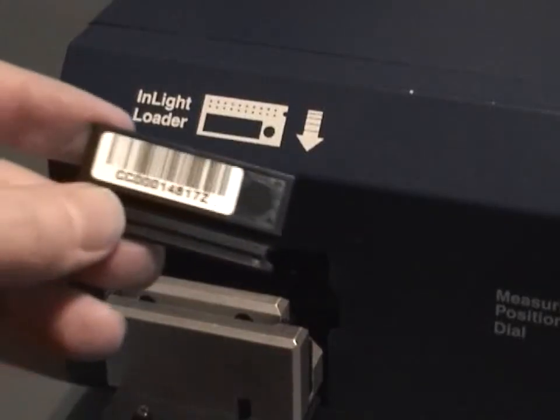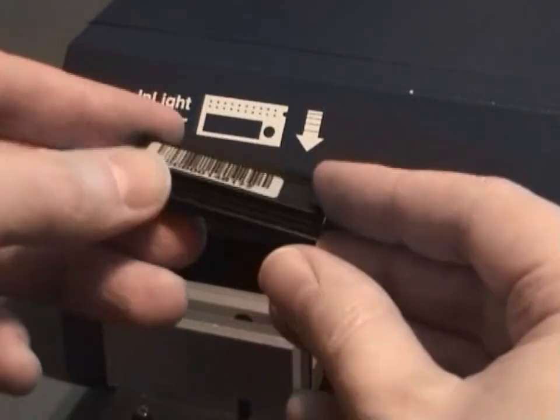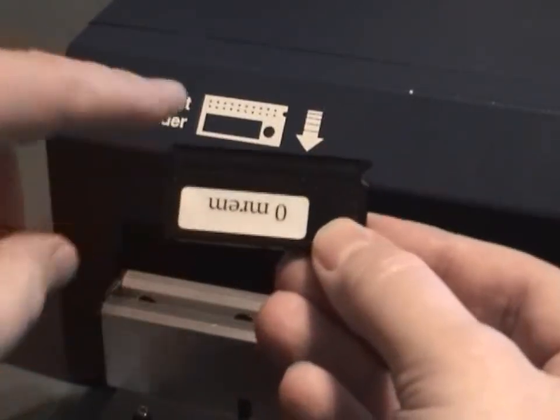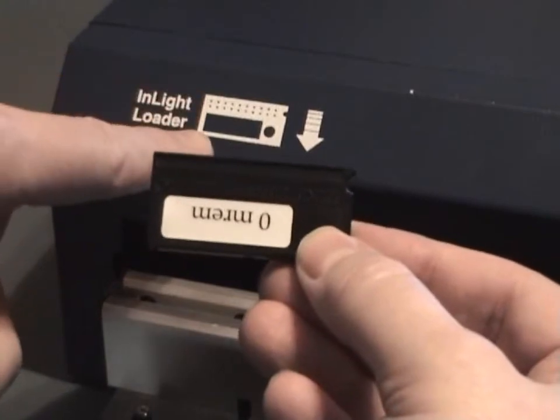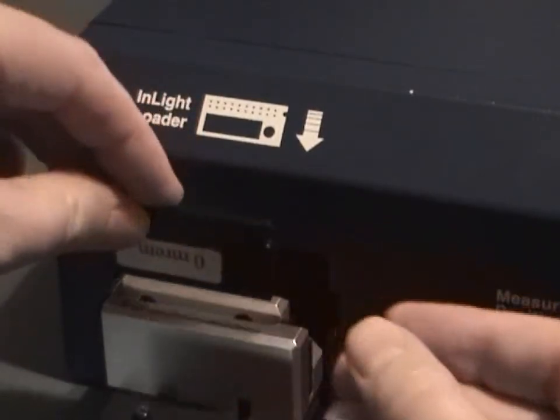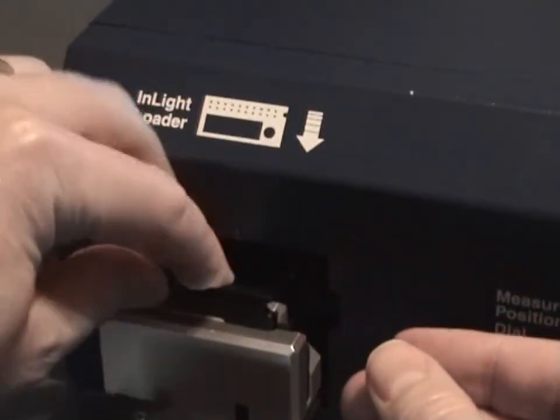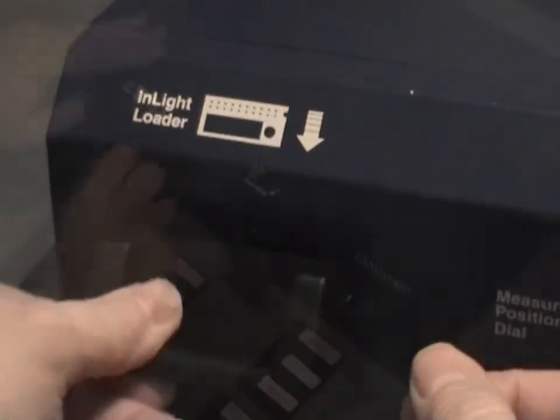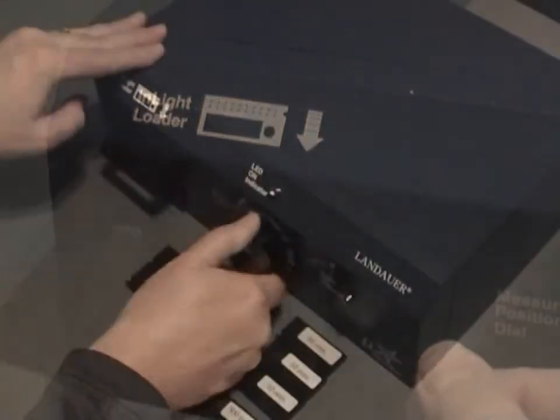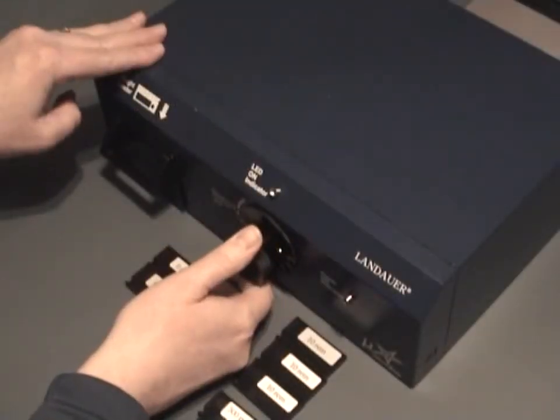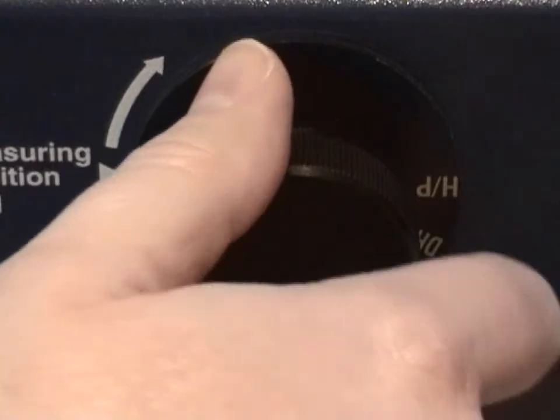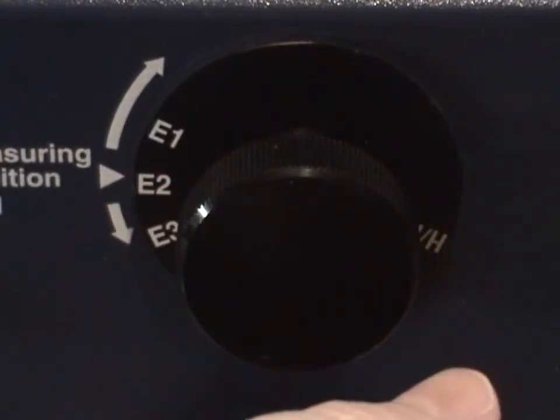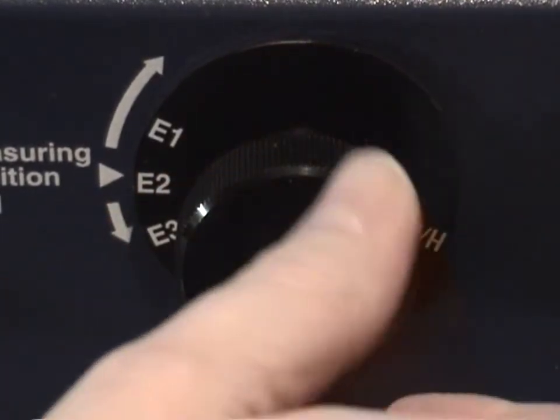Orientate the badge as shown on the front of the MicroStar. Then place the badge in the dosimeter block. Begin reading the badge by turning the knob clockwise to the E1 position. When the LED indicator turns off, turn to position E2.